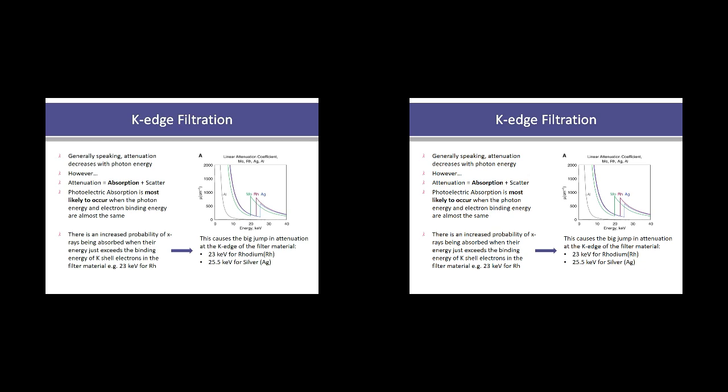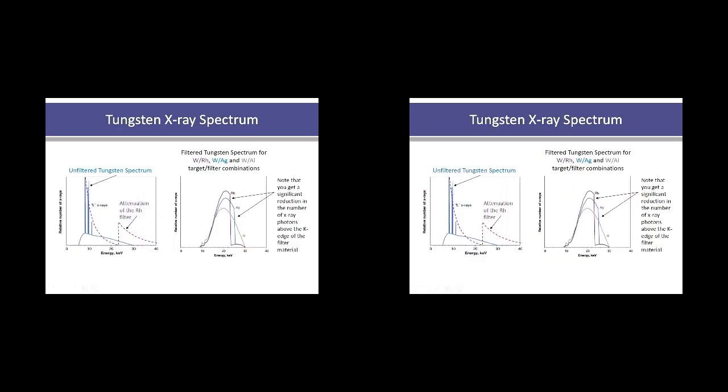So remember, at this stage, we've generated our X-rays. We're now placing the filter between the X-ray tube and the patient, before the beam actually reaches the patient. That's shaping the spectrum in a way to give us the most useful energy range that we can get then. So I hope this is all making sense. As I say, I do apologise. It is quite a difficult topic, and it does rely on you having a reasonable knowledge of the topics building up to it as well.